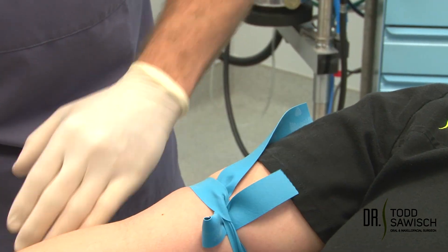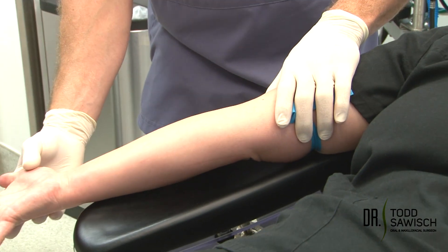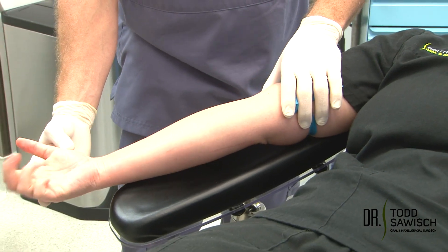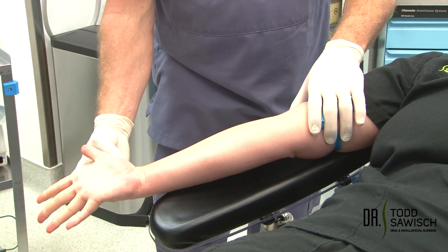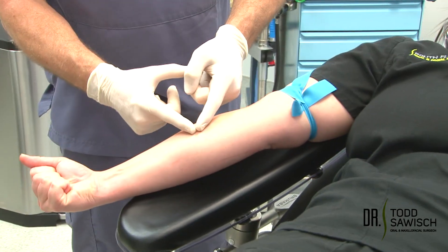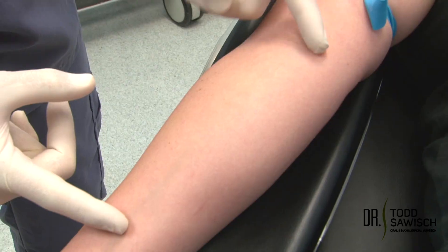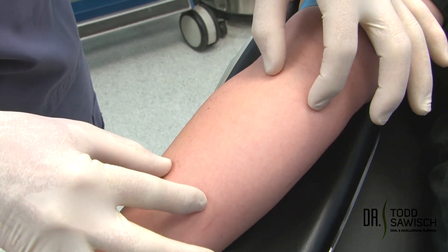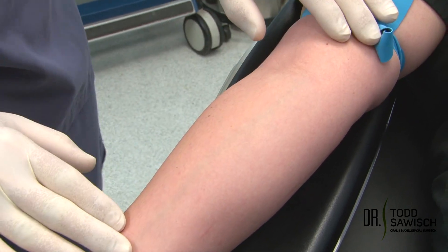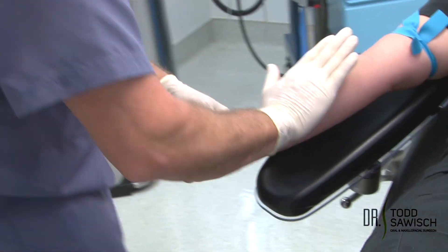You have to have the arm board in good position to give support. I'm going to have the patient open and close their hand — close, open, close, open, close, open — hold a nice tight fist. We're going to do a little tapping on the arm. You can see a nice linear vein here on the forearm; this is going to be the one we're going to attempt to draw from.